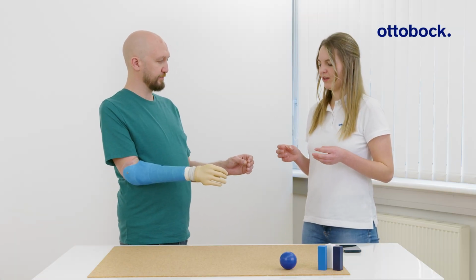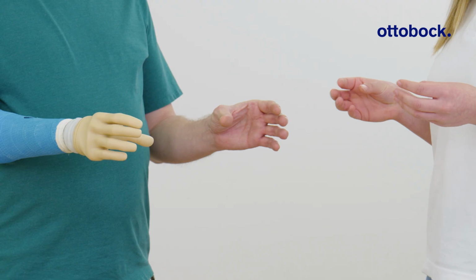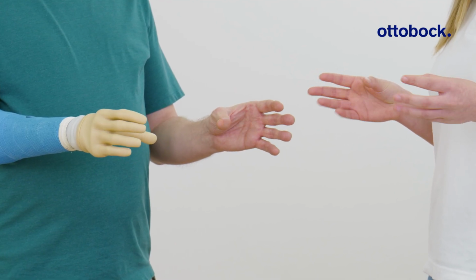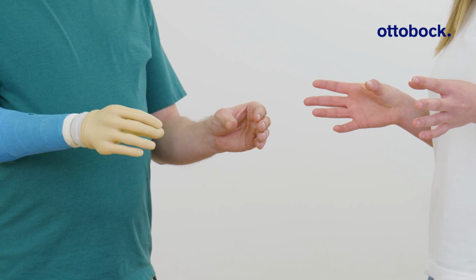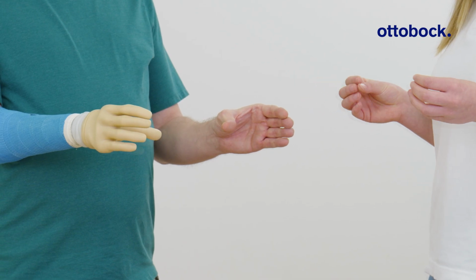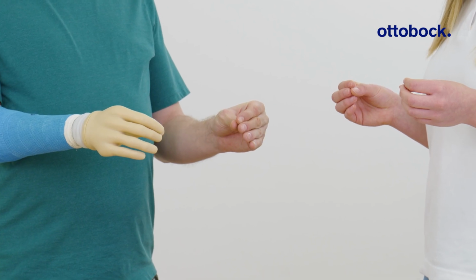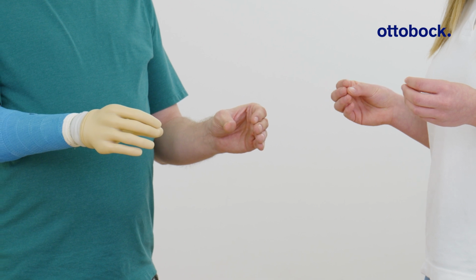Practice opening and closing the prosthetic hand steadily at different speeds. The goal is to develop proportional control, the ability to adjust movement speed and precision based on your intent. Now, slow it down. Open very slowly, then close just as slowly. Next, try opening the hand only halfway before closing it again.